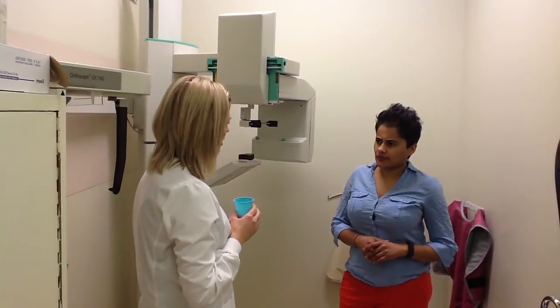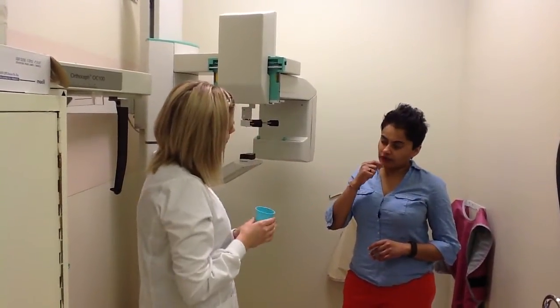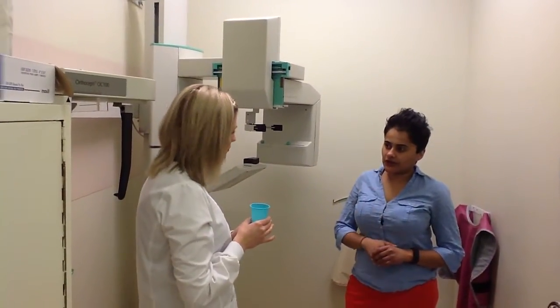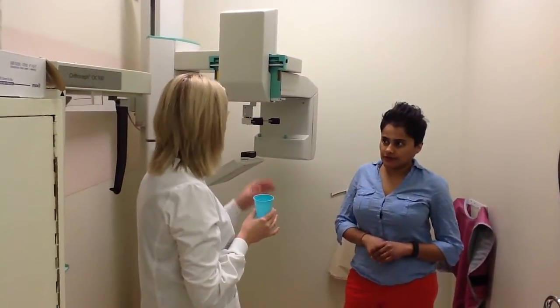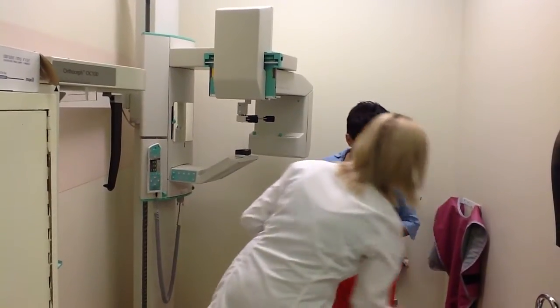Okay, and do you have any removable appliances or dentures? No, I do have like a metal wire at the bottom of my teeth, top and bottom. Is that okay? I can't take that. Yeah, well, it'll show up on the image, but we can't remove it, so it's okay where it is. Excellent. Okay.